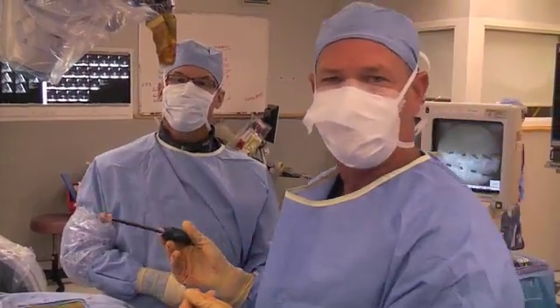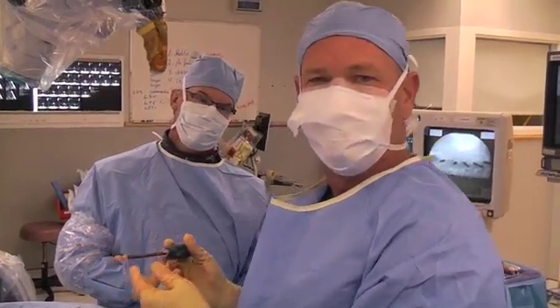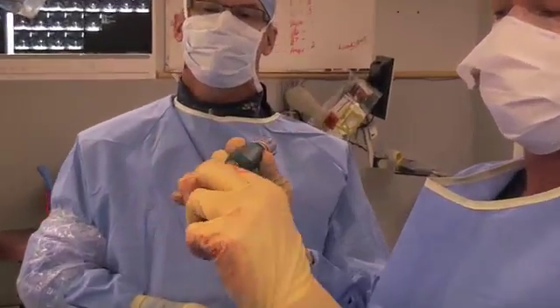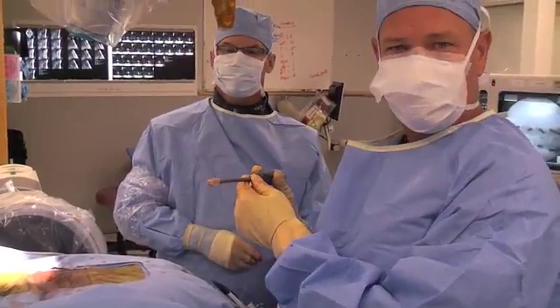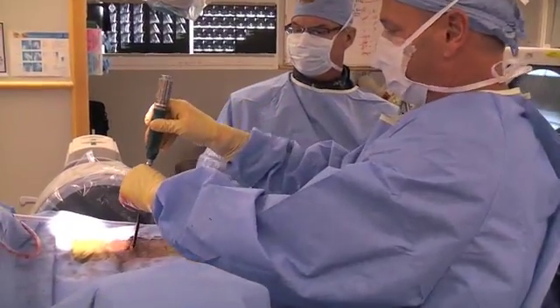We've removed the crane from the room that it took to get the template out of the interbody space — just kidding. Bottom line, this is the T-Peak implant. It's got two rails on the posterior and anterior surface, filled with autograft for interbody placement. We're doing this at the L2-3 level. We've already created the groove, and we're going to come in vertically, fluoroscopically.